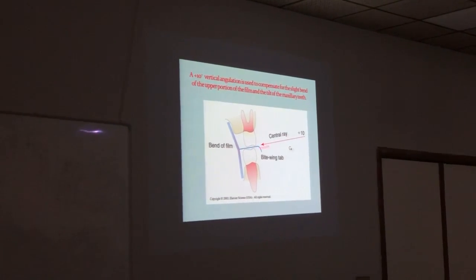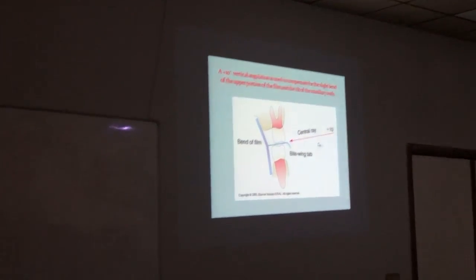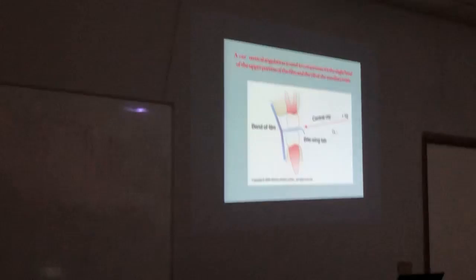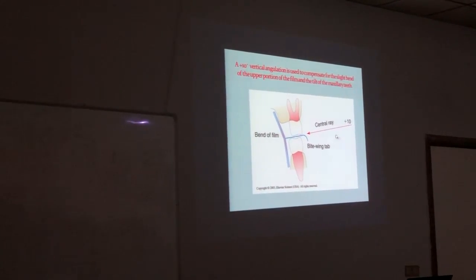The biting is not straight. The lingual cusp is more bulging and bigger than the buccal, so the patient will bite on the lingual side, so there will be some angulation.